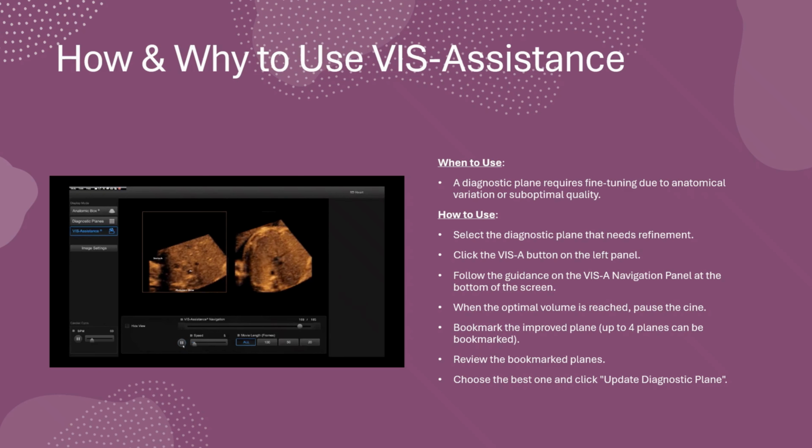You can save up to 4 planes. After viewing your bookmarked options, choose the best one and hit Update Diagnostic Plane. That updated view will now replace the original in your set of 9 standard planes, and just like that, your image quality and diagnostic confidence get a solid upgrade.